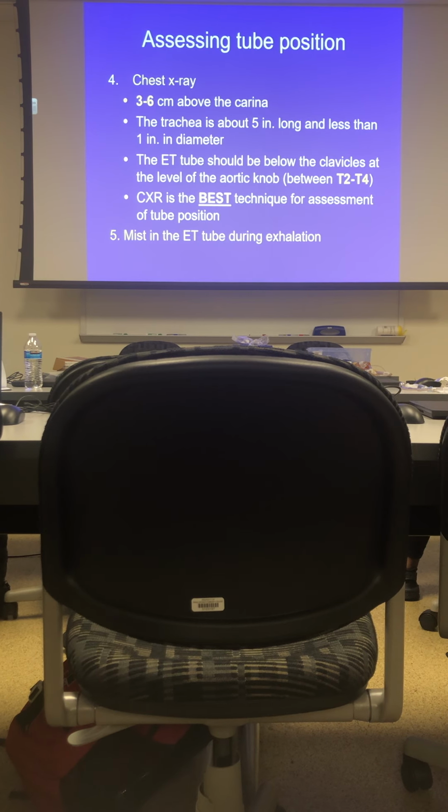Okay, what is the best way to determine tube placement? Best way. You guys gonna get that right on an exam? What's the easiest way? Quickest? Chest rise. Best? X-ray. Quickest is chest rise. Best is chest X-ray. Okay, don't get that wrong.